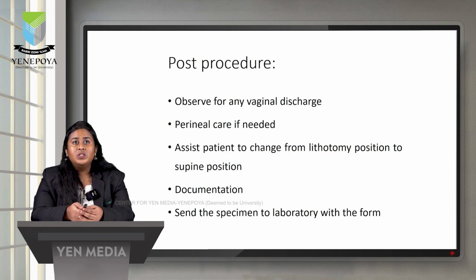So after the procedure, we have to observe the patient for any vaginal discharge, and if needed, perineal care has to be provided, and we have to assist the patient to change from lithotomy position to supine position. Once the documentation is completed, the specimen will be sent for laboratory along with the requisition form.